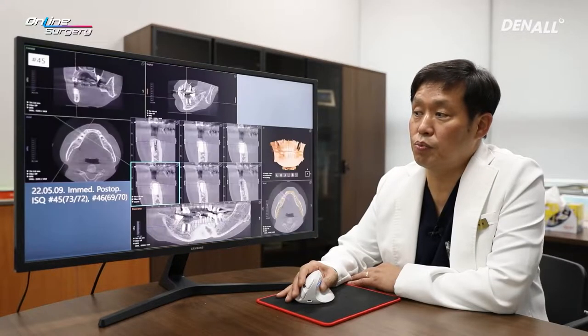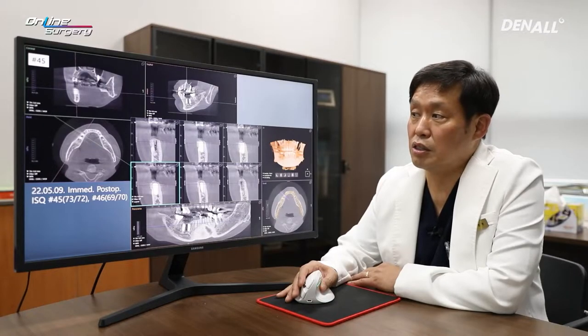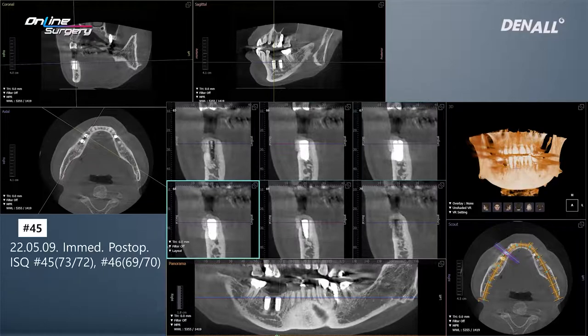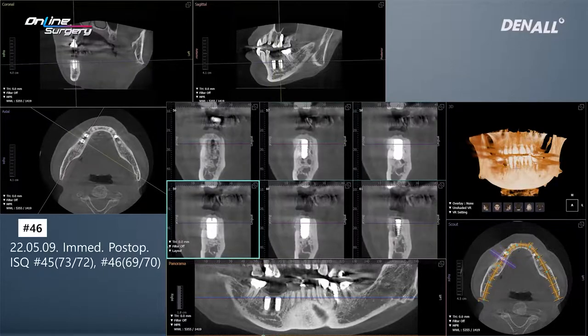Immediately post-op, in number 45, additional bone graft was done on the buccal side as well as on top of the implant. In number 46, additional bone graft was done to enhance the buccal wall.